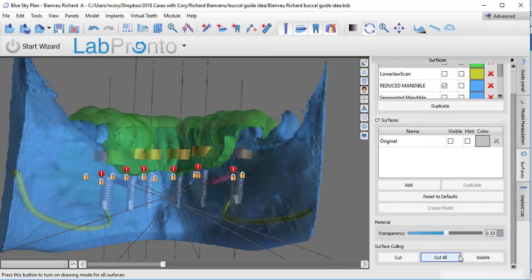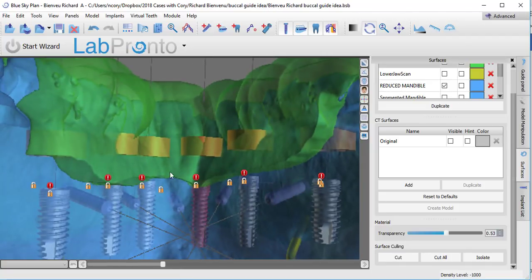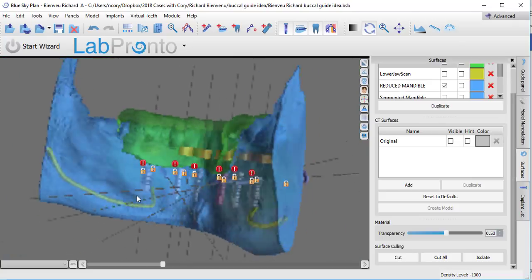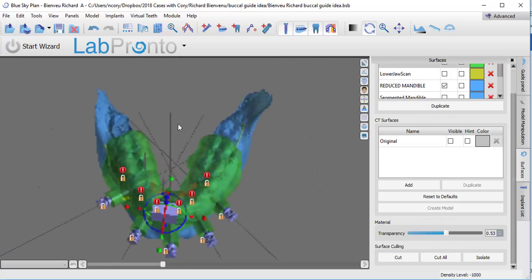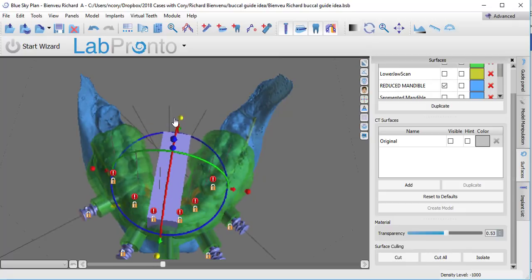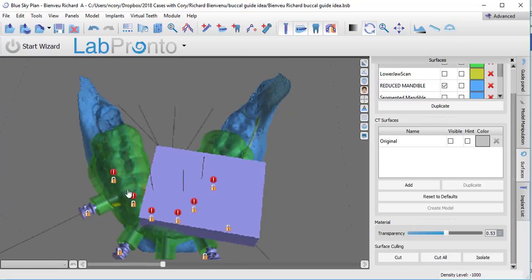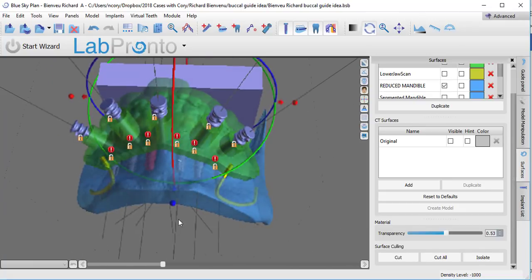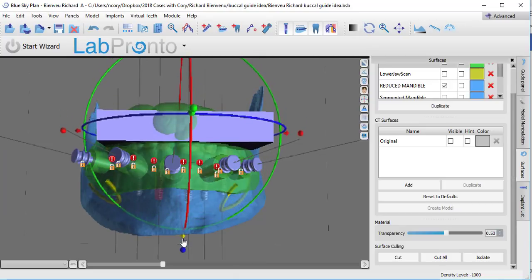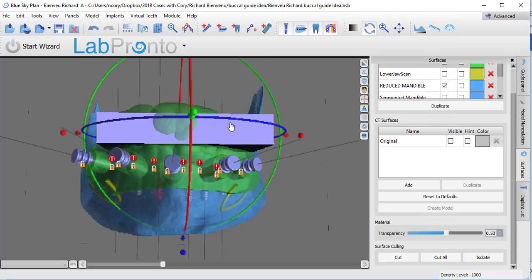And if you come down to the bottom of the surfaces panel, you're going to see a button that says cut all. So we're going to use this button. I like to start here in the middle. I like to make my bone cut right here, and then I'll spin it and do it at the side. Now, some people have done this as just one massive plane cut, and you can do that by adding a window. When you use the window function, what that enables you to do is to stretch this thing. You can make one gigantic window, which then is going to end up becoming a plane cut. But the reason I don't tend to do that is because I don't like an abrupt plane cut for my reduction, right? I like to really strategically locate that, and I like my jaw shape to end up as a smooth flowing shape. So while this is an option, that's not what I'm going to do here.